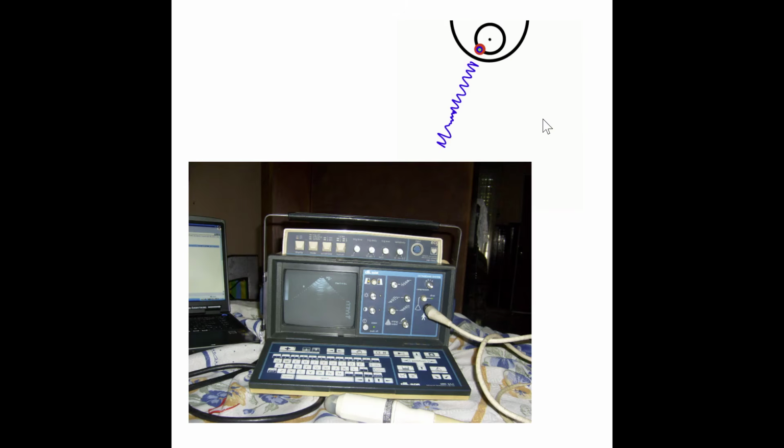So similar to the mechanical transducer, we have the circular elements all moving as a group together by motor. For each crystal that is being activated, they are going to send their own pulse out with their own focus. So in this example, if we have 4 crystals activated, 4 pulses are needed for each scan line.